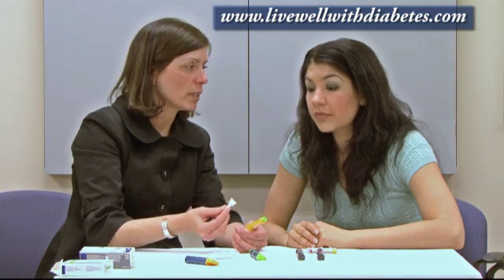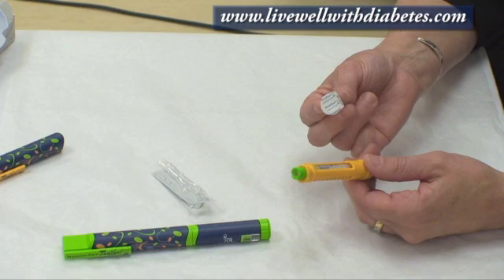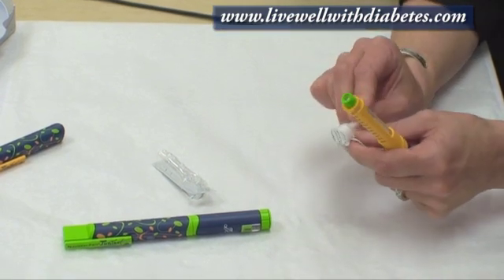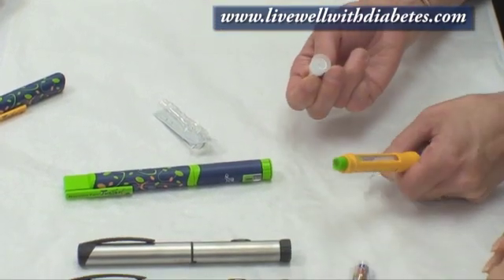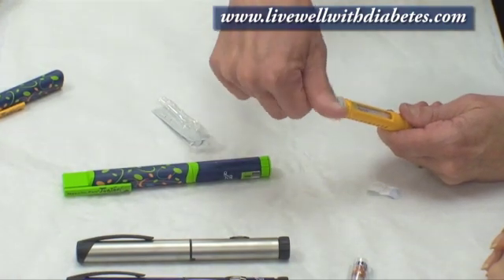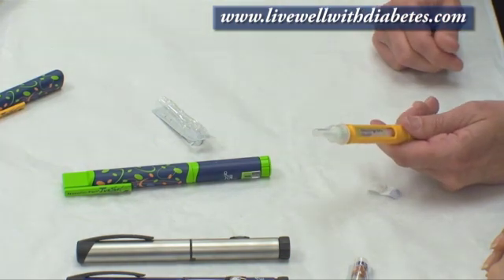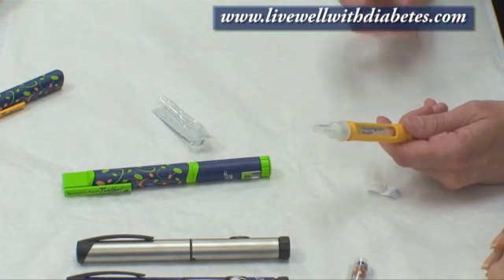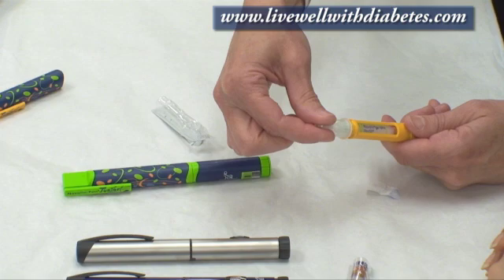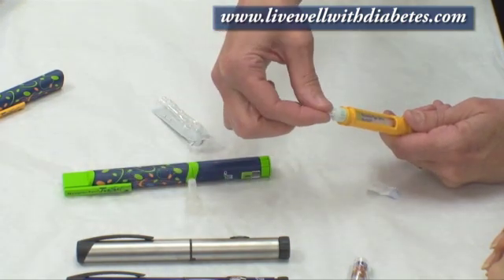The next step is to attach a needle to the end. Each needle comes with a piece of paper on it — you pull the paper off and then screw the needle over top all the way. Each needle comes with two caps: there's an outside cap which you hold by the tip and pull off, then the inside cap — hold by the tip and pull that off.